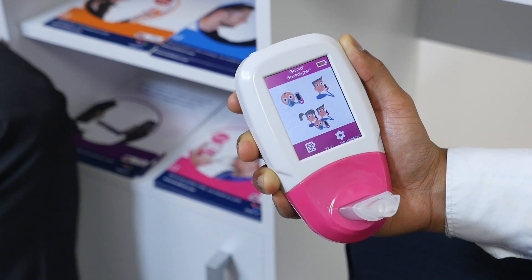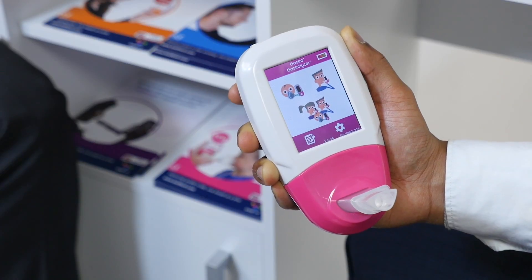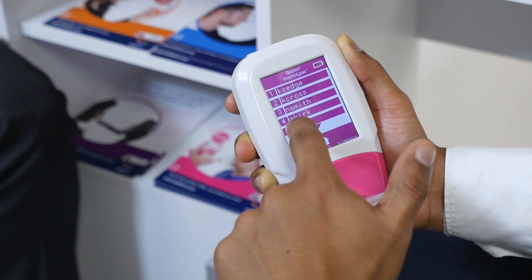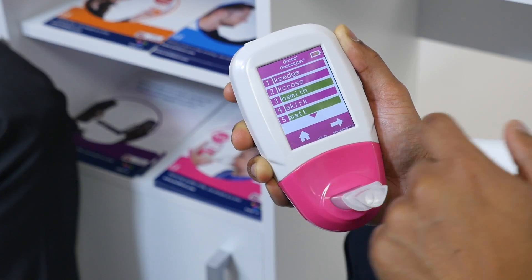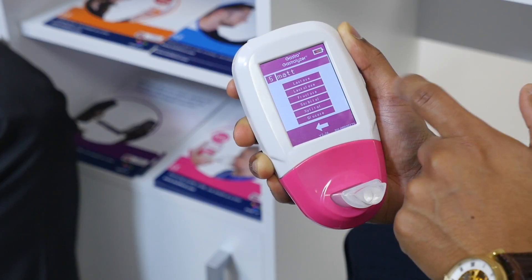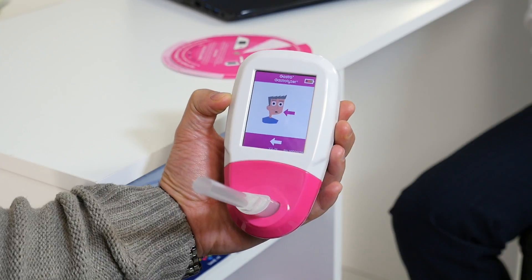The GastroPlus Gastrolyzer can follow protocol breath testing for up to 10 patients at one time. Press on the third icon for protocol breath testing and select the profiles of the patients you wish to test. Next, select which protocol each patient will be testing for. The first test will be the baseline reading. Once the patient is ready, they can press the breath test icon to commence the test.